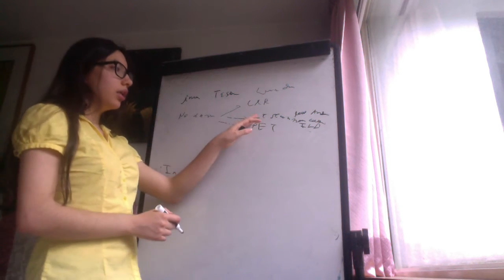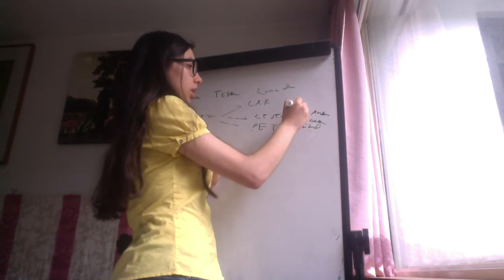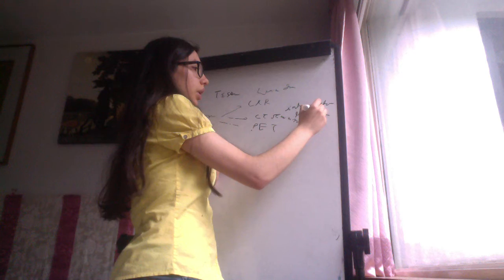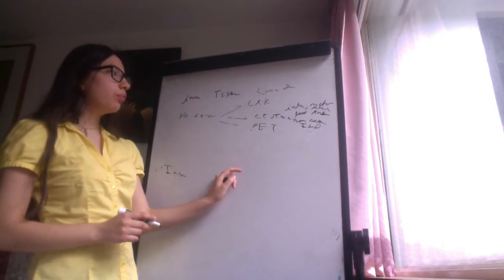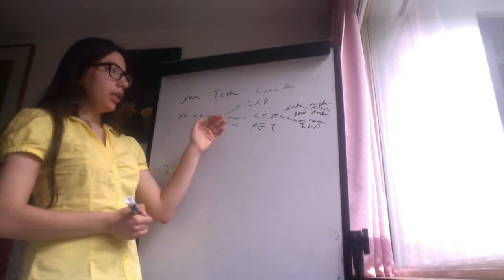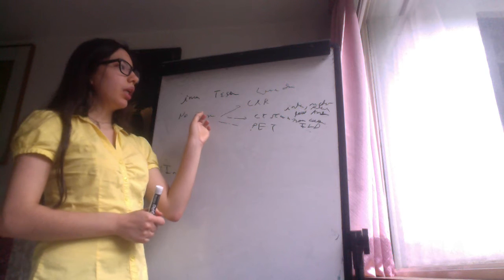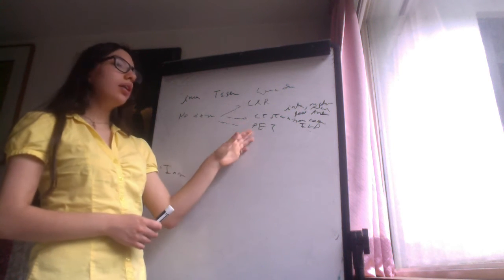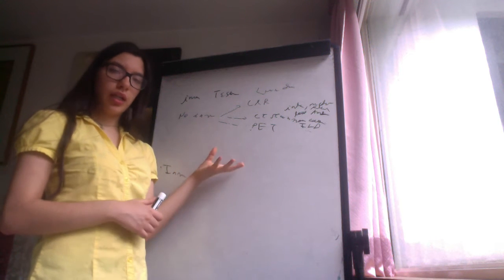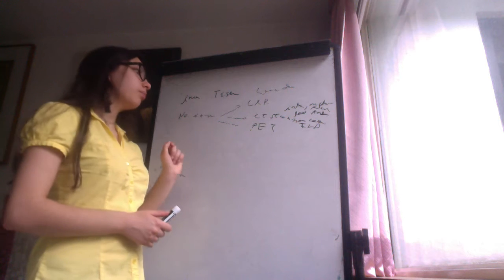A CT scan is done to assess the interstitium of the lung, mediastinum, and pleura, and is less sensitive to the movement of the patient than the chest X-ray. And we can see in real time, visualizing the imaging, the high resolution CT scan has smaller slices, so we have high resolution, and that is a CT scan without contrast.